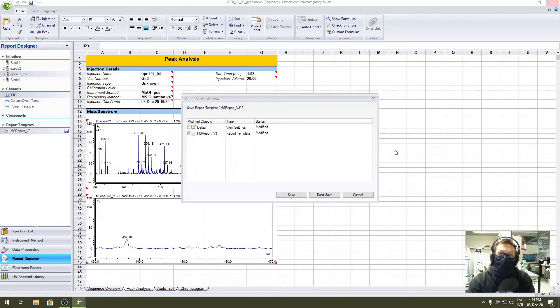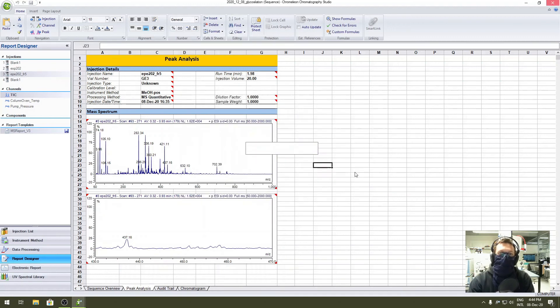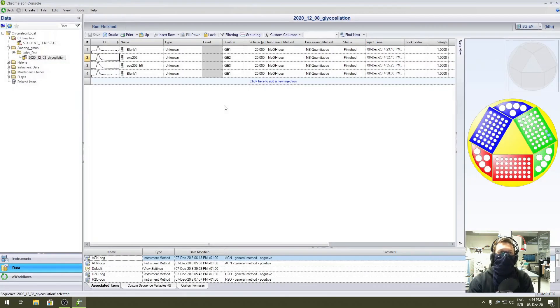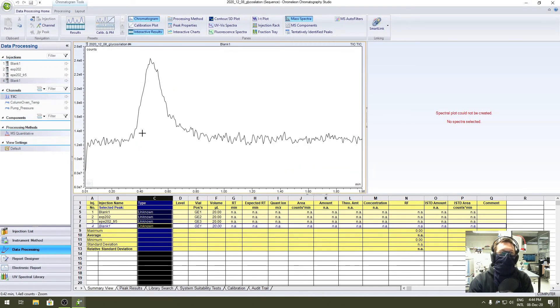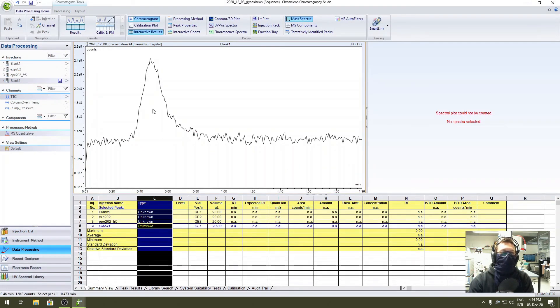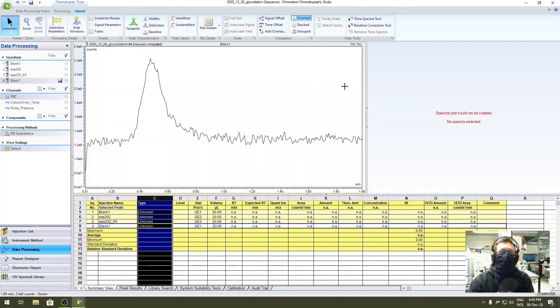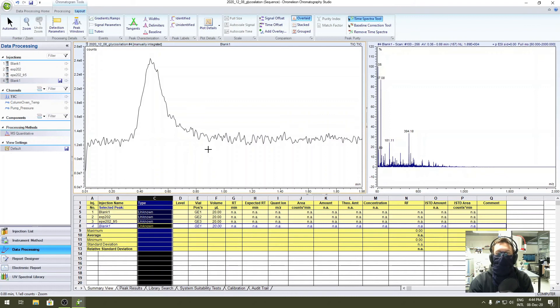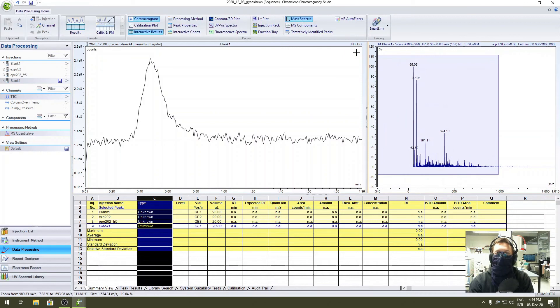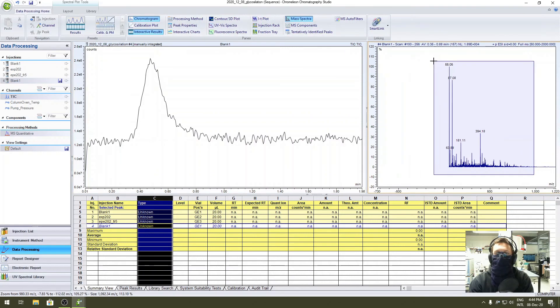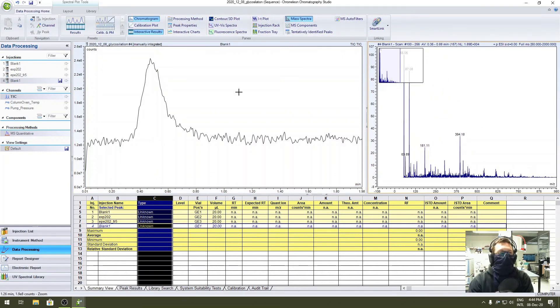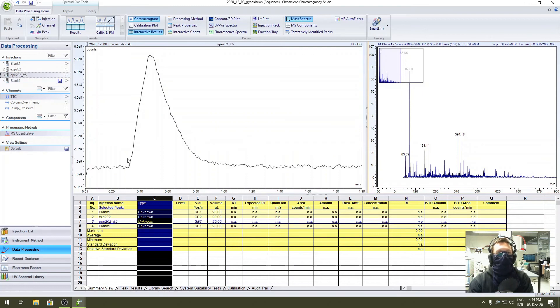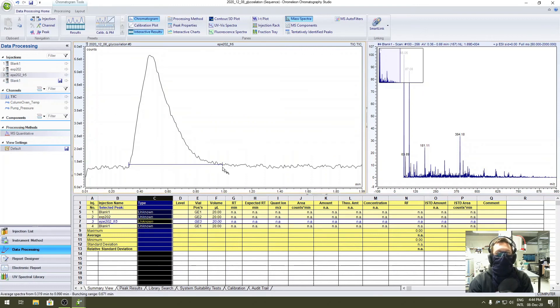Last but not least, there is one very important step, and that is checking the blank after it ended. You need to go for the layout time spectra tool, select, and check that there are no big masses in the residual spectrum. In my case it's the case. I'll check quickly with fraction 5 to do a comparison. You can see that the peaks from fraction 5 are gone in this fraction.